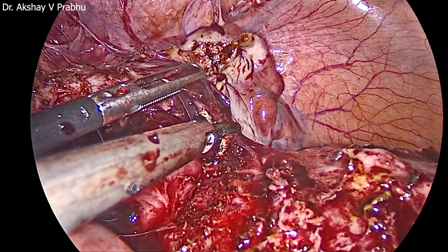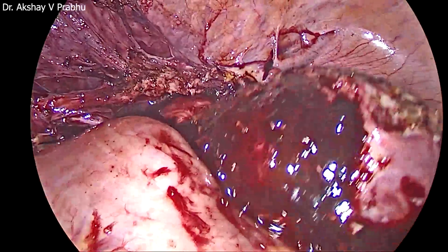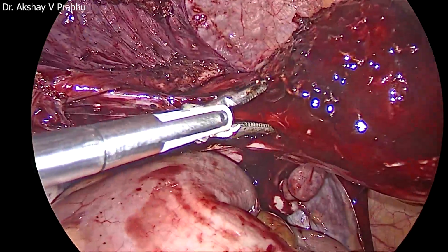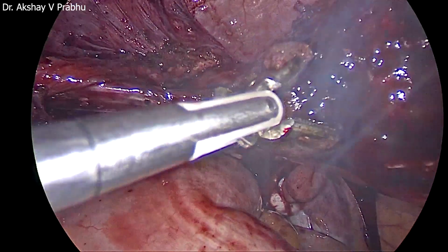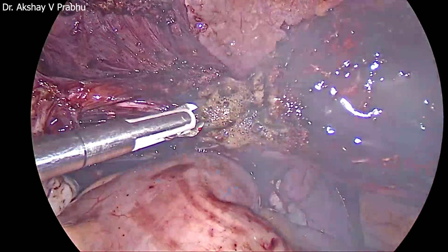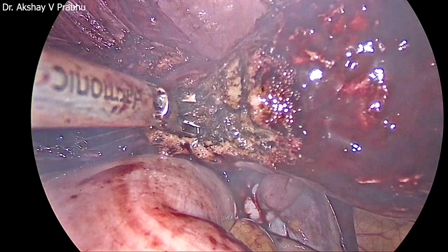Now the last fragment of the bladder adhesion is left. With every cut, revise the tissue. Now it's very clear. The bladder is down. Cervix is visible. This is actually a tissue adhesion band, but because anatomy is distorted, there will be vascularity in that also. Plus the uterine will be behind it because we have not separately tackled the uterine. You can also see that the bowel is so close. So be very careful while cauterizing or cutting.